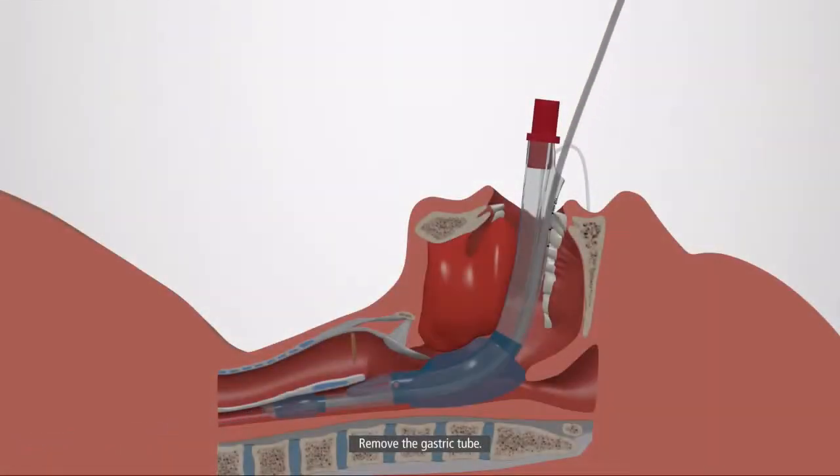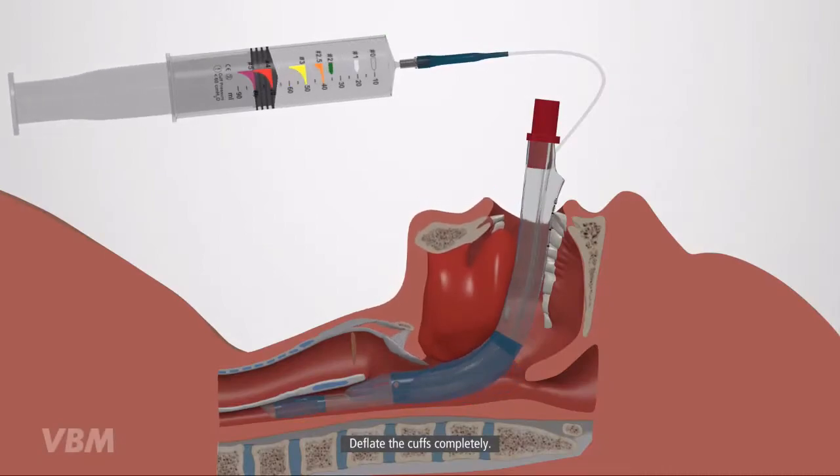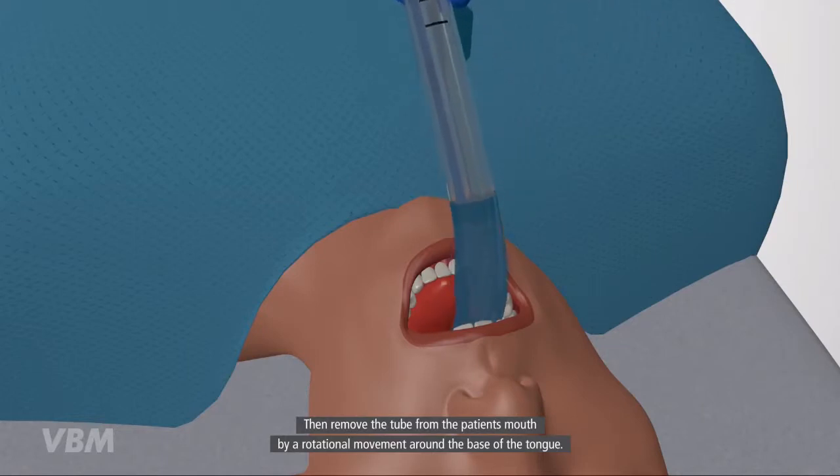Remove the gastric tube. Deflate the cuffs completely. Then remove the tube from the patient's mouth by a rotational movement around the base of the tongue.